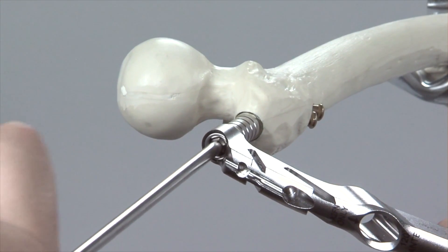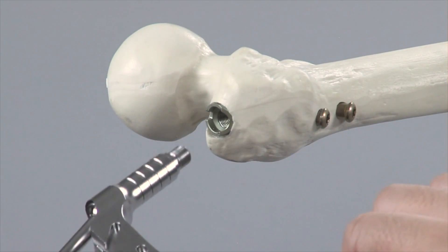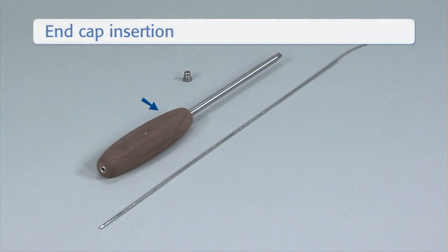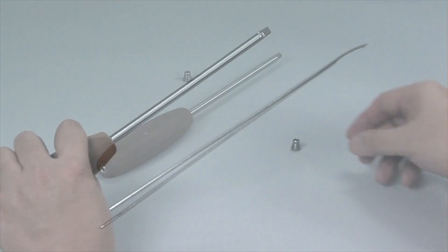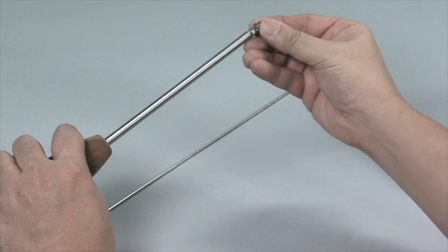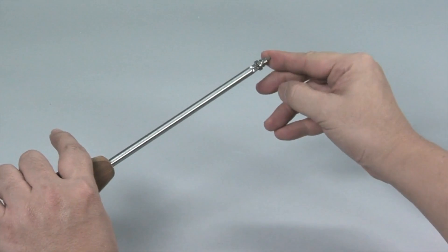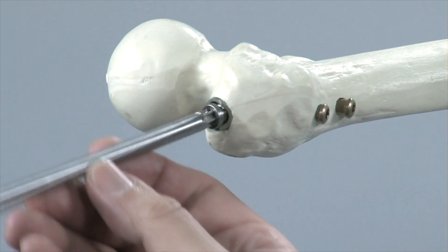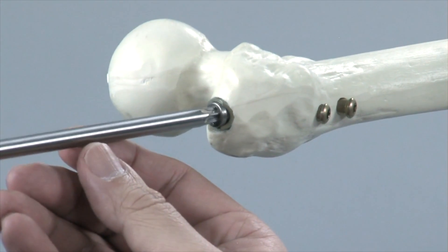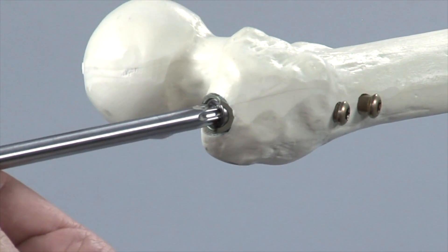To insert the end cap, the cannulated T40 star drive screwdriver and the 2.8mm guide wire with hook are needed. The end cap is fixed on the end of the screwdriver and the blunt end of the guide wire is slid through the end cap and the screwdriver. The hook of the guide wire secures the end cap during insertion. To minimise the chance of cross-threading, the end cap is turned anti-clockwise until the thread of the end cap aligns with that of the nail, then turned clockwise to thread it into the nail. The screwdriver and guide wire are removed.